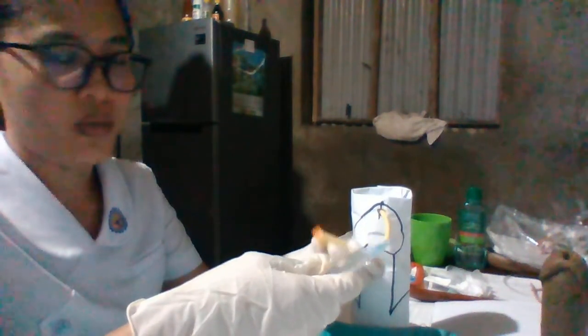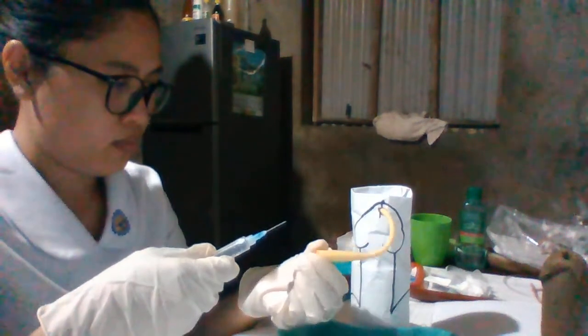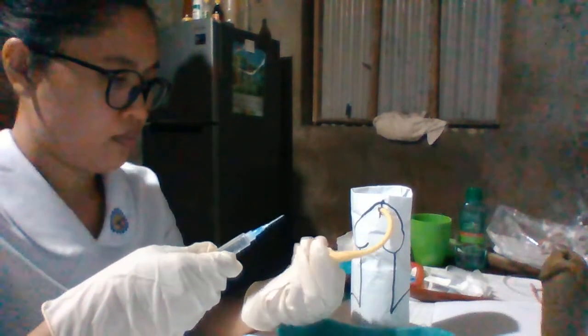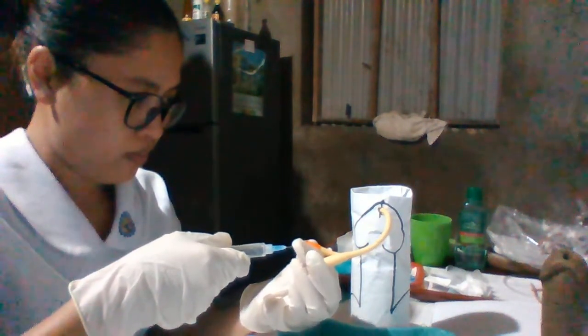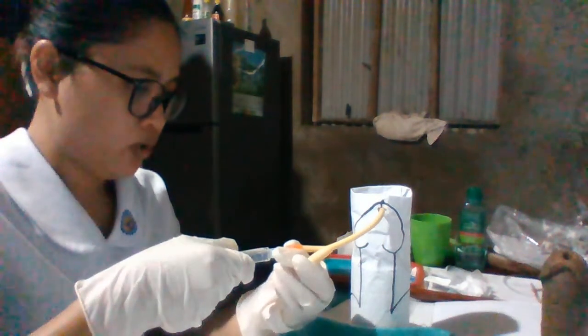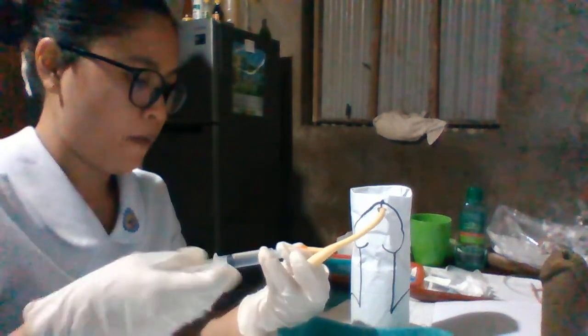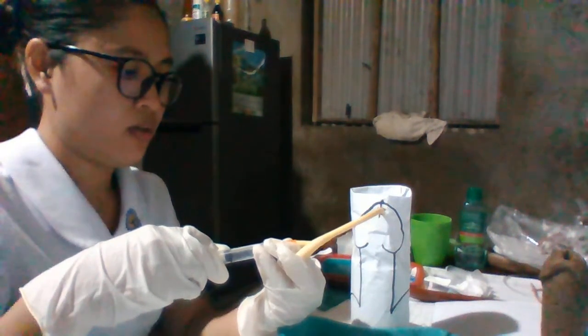So we need to hold this one with the non-dominant hand, then insert. We're going to do this so that it will inflate and will not be removed easily without the physician's order.